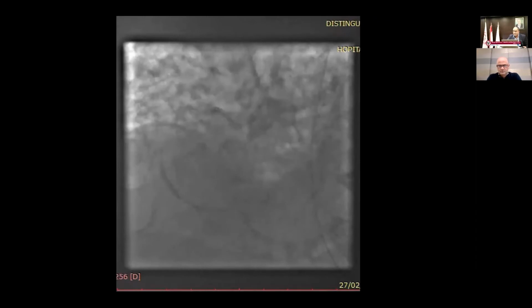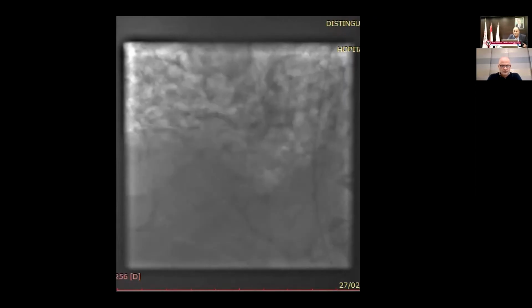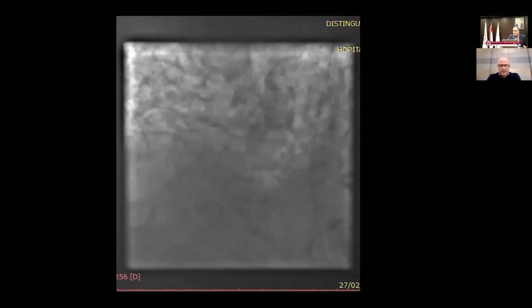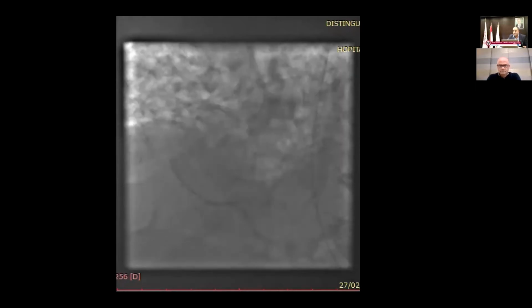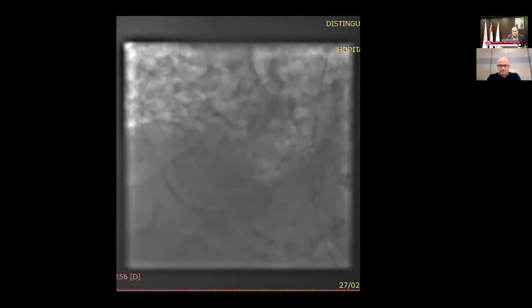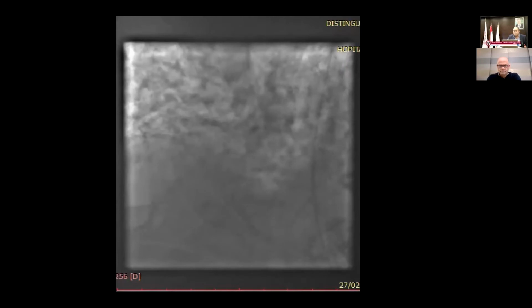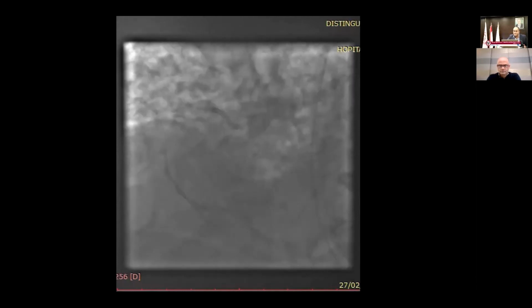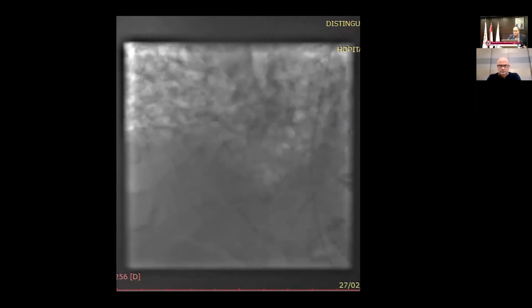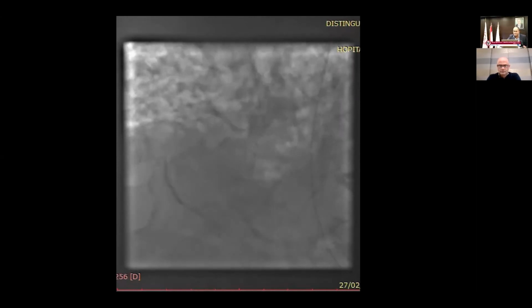Also, we have doubt that we are not in the good lumen after crossing two wires distally. So I go to a microcatheter and distal injection to verify. Although I used the Amplatz AL 0.75, I cannot cross the stent through the lesion. So that's why I changed the guiding rapidly, and the patient is still deteriorating hemodynamically.